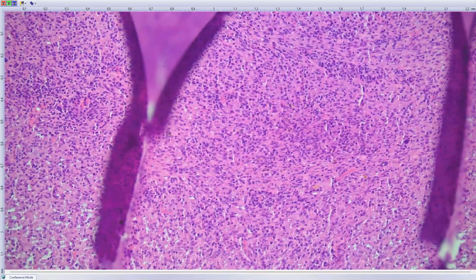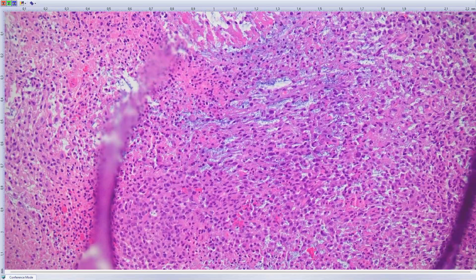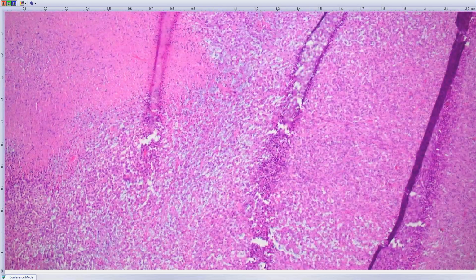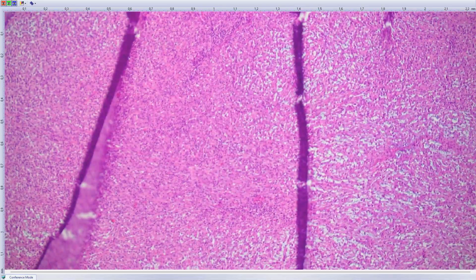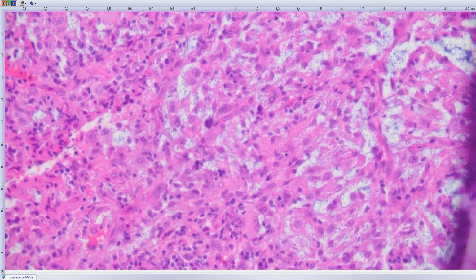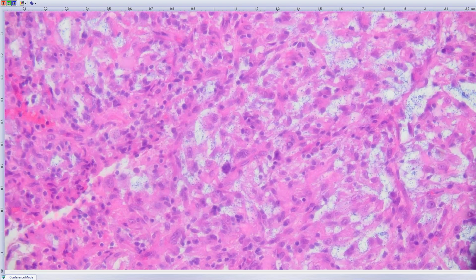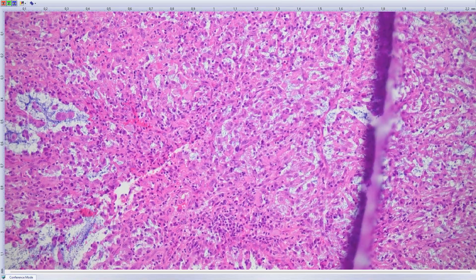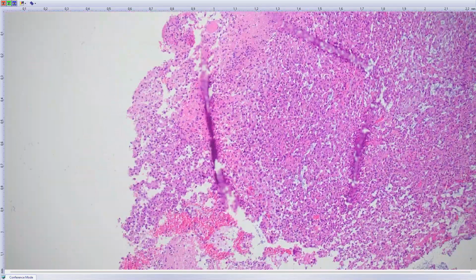but of course you have to do immunohistochemistry to exclude some weird melanoma or some undifferentiated carcinoma. There's a lot of chronic inflammation in the background and scattered highly atypical cells. I mean, all the cells are atypical, but like this one in the center, it's more hyperchromatic and more screaming malignant than the others. And also necrosis is here.